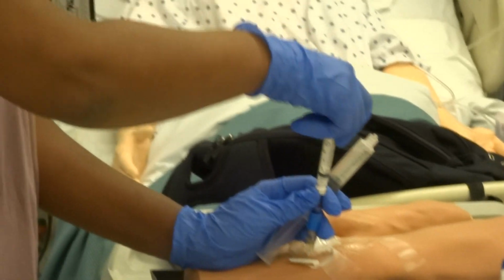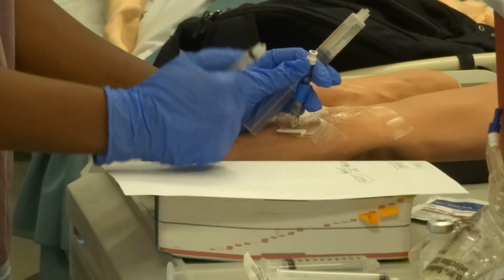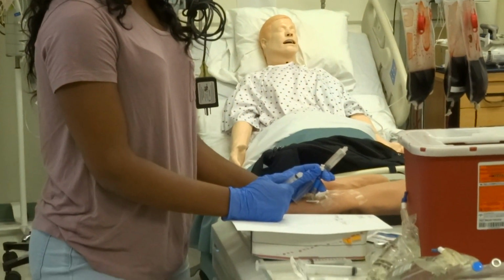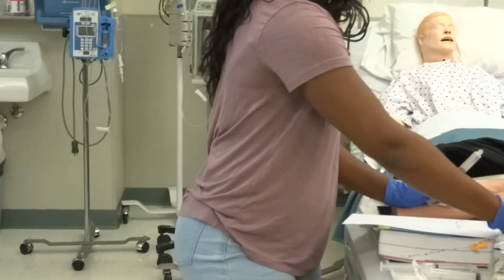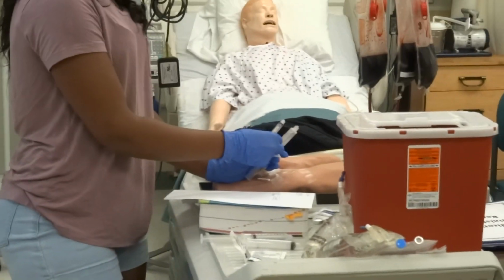Yeah, you could scrub it. Actually, for competency, it's probably best to scrub it. In the hospital, I feel like if it's been scrubbed for 20 seconds with chlorhexidine or alcohol, then you're not really exposing too much between switching between the normal saline and the drug. But for purpose of competency, after you flush it to check patency, you can scrub again for another 20 seconds.